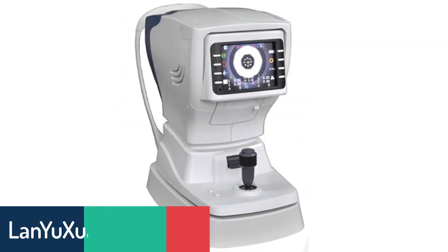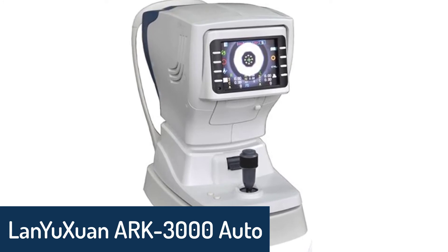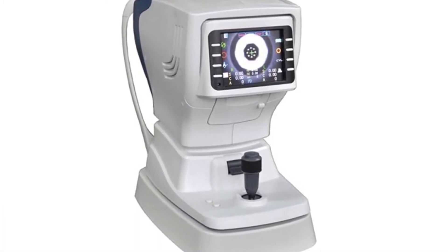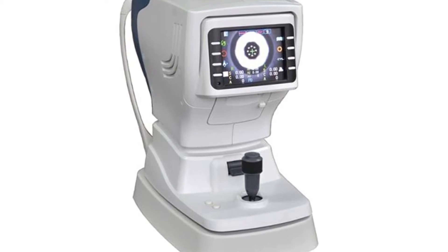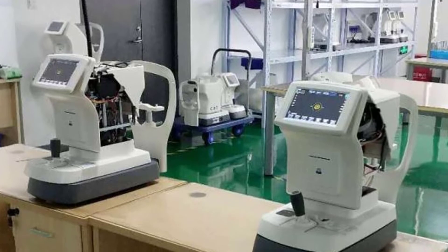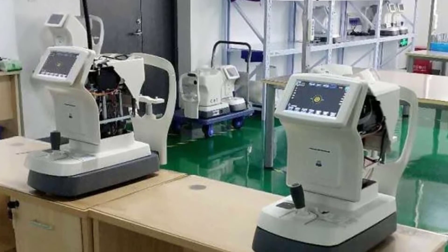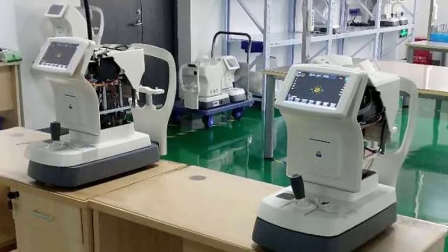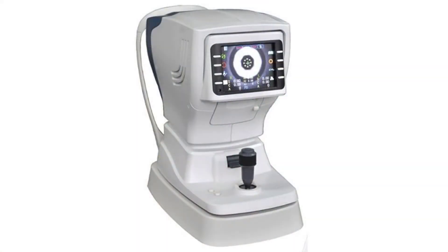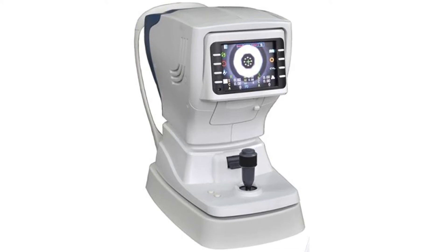Number 3: Lanyuxuan Arc 3000 Autorefractometer. The Lanyuxuan Arc 3000 Autorefractometer is a professional medical equipment with the most advanced technology in the world. With innovative technology, it is better than other general ones. The Lanyuxuan Arc 3000 Autorefractometer has been approved by CE, ISO, FDA, and ROHS certification. It is convenient, reliable, accurate, and simple to use.